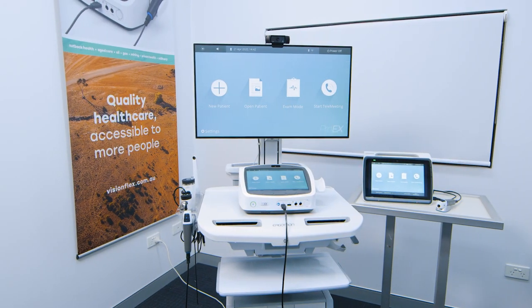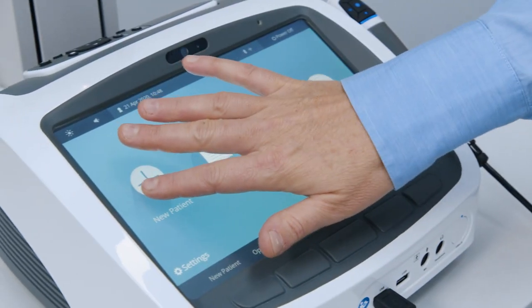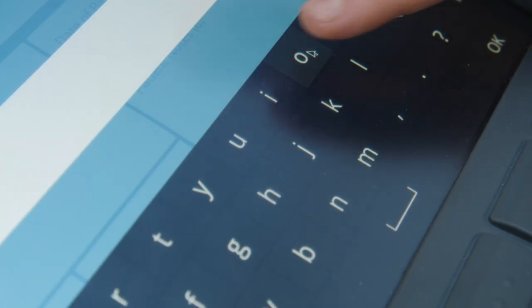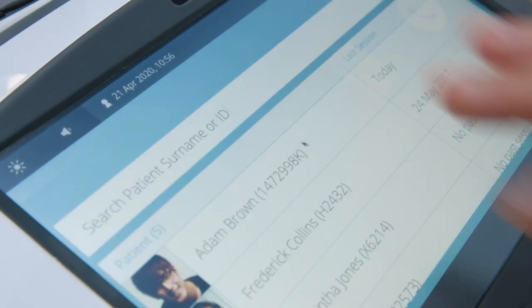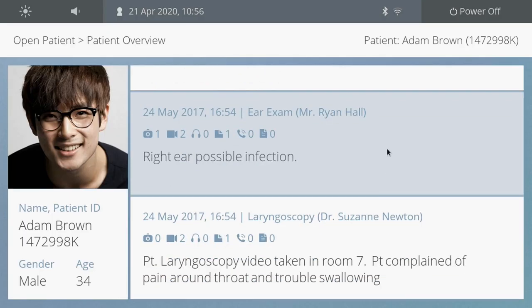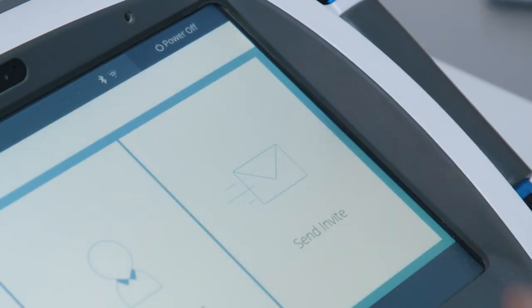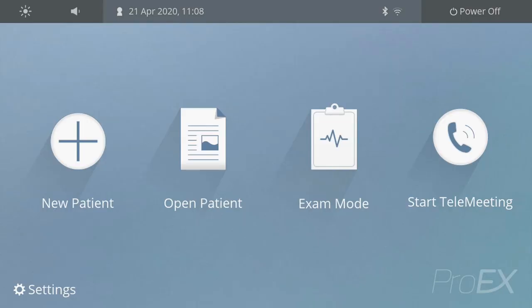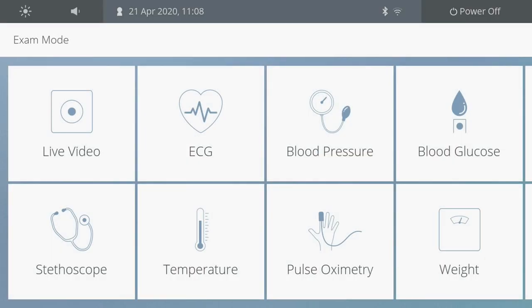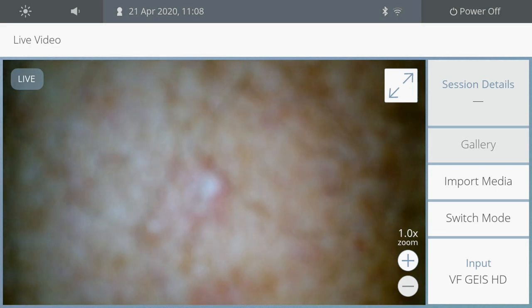Looking at the main features of the ProEx, you can create a new patient, open an existing patient file, start a teleconsultation, or view the different types of examinations by entering into the exam mode from the home screen.